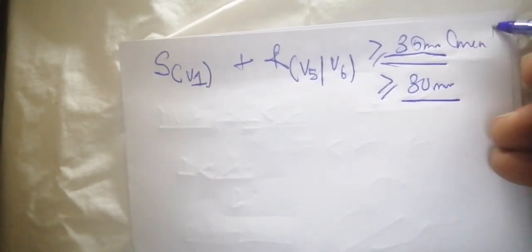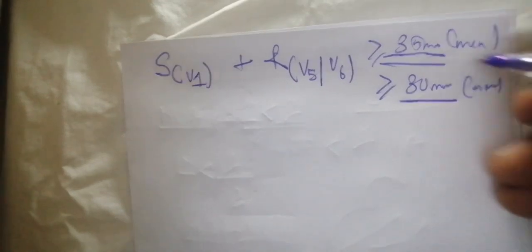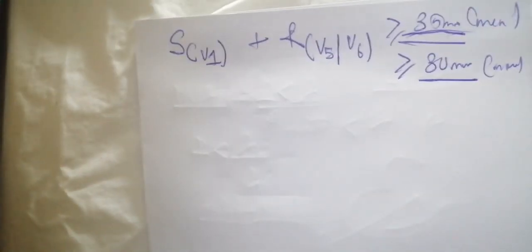Is it clear? But it has to be normally in men and women. But just put in mind 35 millimeters. That's the best response.